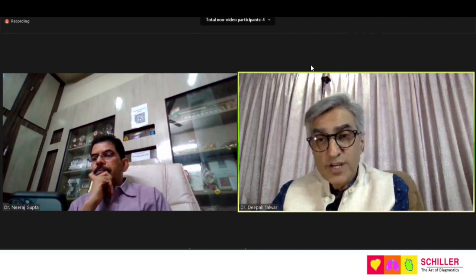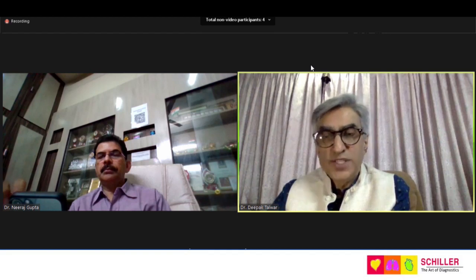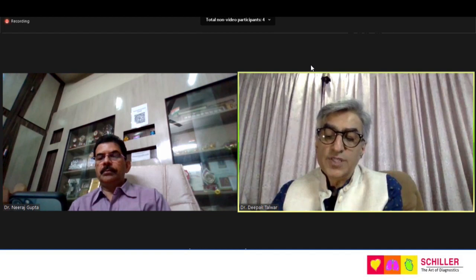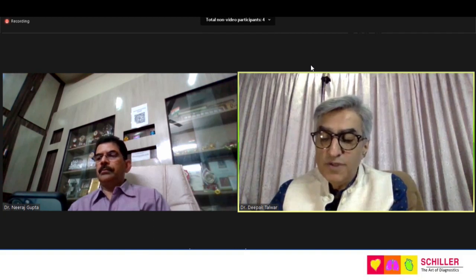For a diffusion capacity test, again, the calibration is very important. We need to calibrate the machine, but we don't do it daily. For a diffusion study, we do it once a week. Calibration is basically to look at the VA. If the VA and the analyzers are not correct, then the results will not be correct. So we need to use the same gas, analyze it, and look at the calibration standards also. So we do it once a week for the diffusion study.